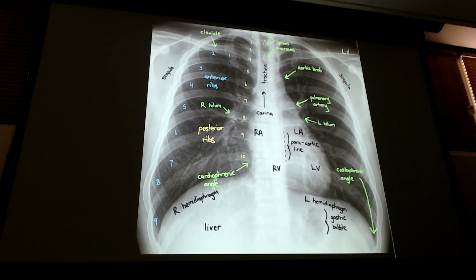So what is the hilum? The hilum is an area where your vasculature and your nerve bundles kind of come together through the lungs. So if I have a bundle of vessels or vasculature that's filled with what? Vasculature, blood, right? Fluid. Nerves, also soft tissue, right? That's why it's more radio opaque right in this area, because it's a bundle of those. We have a bunch together, all right over here, my right hilum. The left one sometimes gets hidden by the left atrium and the pulmonary vasculature, sometimes it's not, it just all depends. But that's where your hilum are at. They're in this general region, just outside of the spine, in that area.